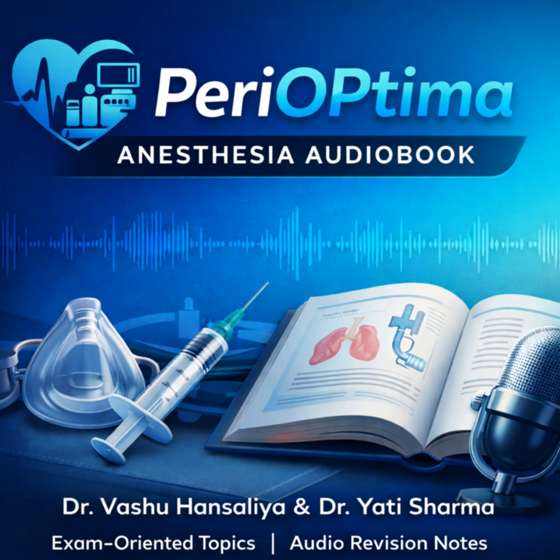Okay, so let's flip the coin. Let's talk about the other side. Pressure-controlled ventilation, or PCV. In PCV, you're setting the other side of that trade-off. You set a target inspiratory pressure, say 20 centimeters of water, and you set an inspiratory time, maybe 1 second. And what does the machine do? The machine pressurizes the airway circuit to 20 and holds it there for exactly 1 second. And a crucial point to mention in the exam, the flow pattern is completely different. Not the square wave.